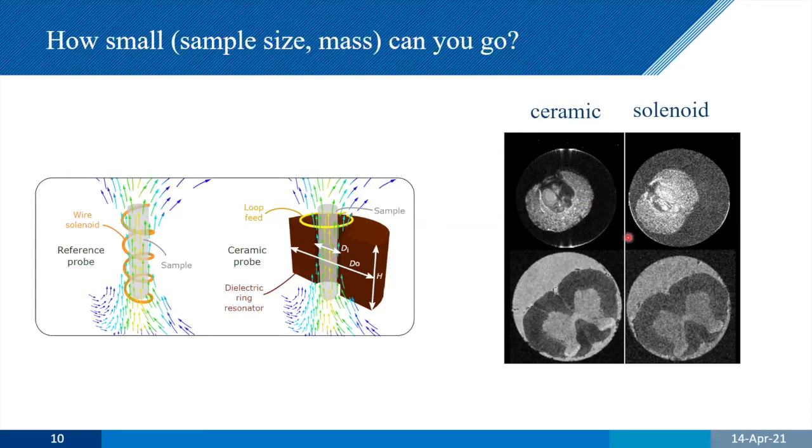And so if you compare what everybody else uses, which is a solenoid, with one of these ceramic resonators, and this is work done with Luisa Ciobanu in Paris, we see a significant increase in signal to noise over here. So by going to high field, by looking at some new elements in terms of the RF here, we're able to get really incredibly high resolution or study very small amounts of material.